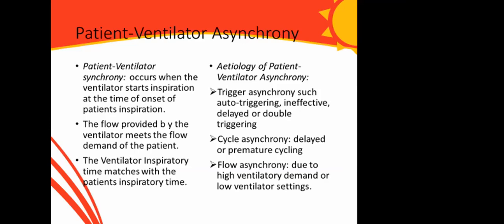The ventilator starts inspiration at the same time when the patient is ready for inspiration. At this point, the support provided is meeting the demands of the patient. The ventilator inspiratory time matches the patient's inspiratory time. That's when we say there is synchrony.